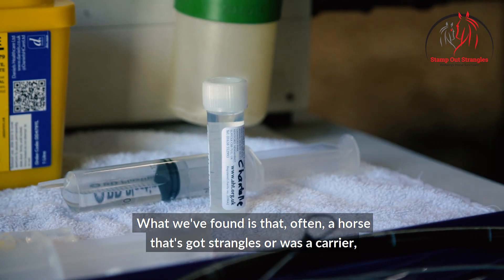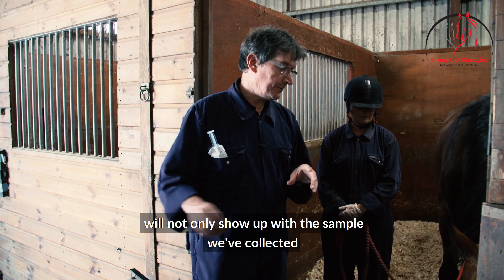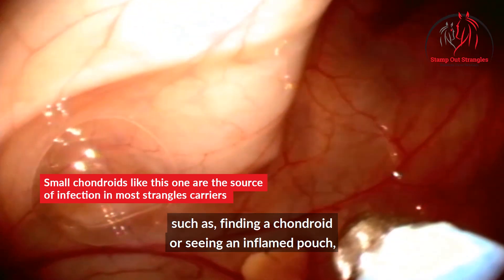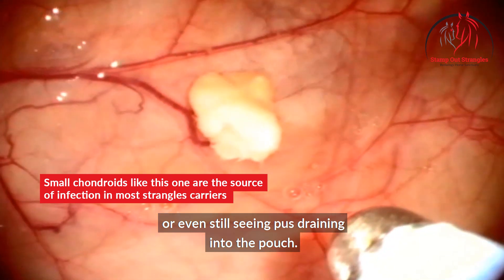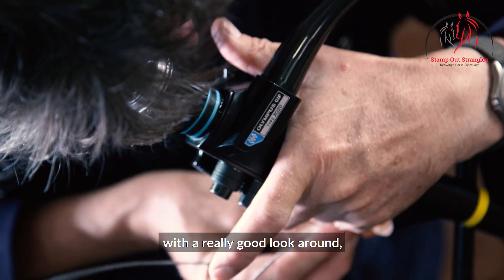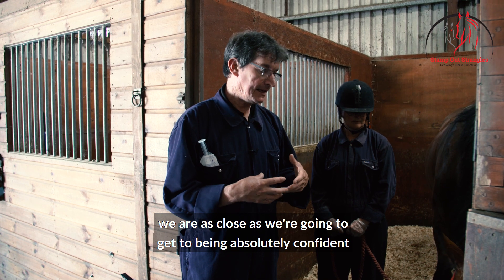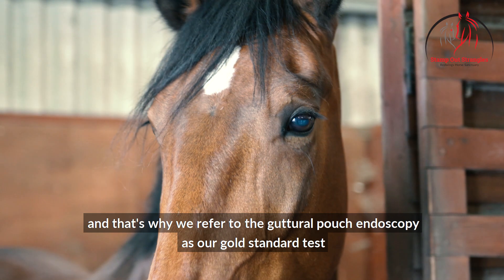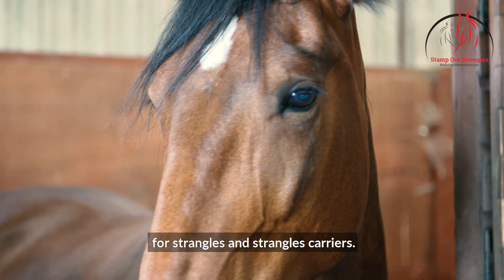What we've found is that often a horse that's got strangles or is a carrier will not only show up with the sample we've collected, but vitally we can often see things wrong in the pouch such as finding a chondroid, seeing an inflamed pouch, or even still seeing pus draining into the pouch. No one test is 100 percent, but if we combine collecting a sample with a really good look around, we are as close as we're going to get to being absolutely confident that a horse isn't infected or a carrier. That's why we refer to the guttural pouch endoscopy as our gold standard test for strangles and strangles carriers.